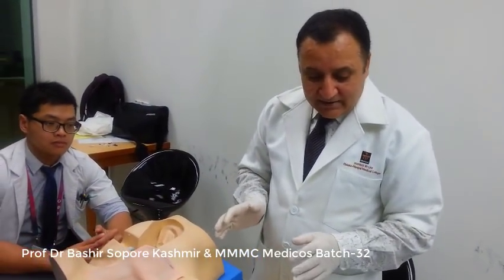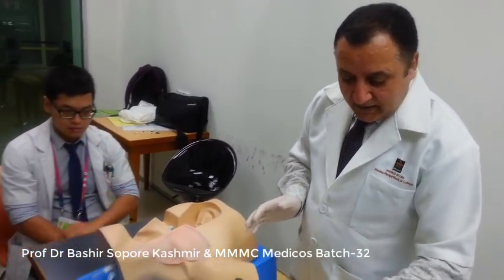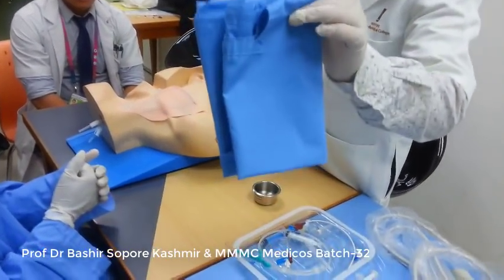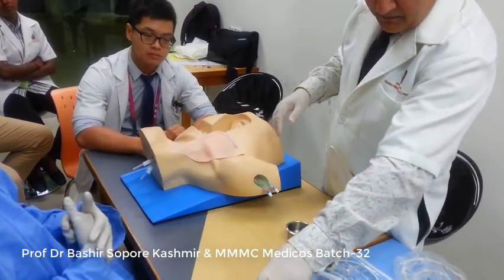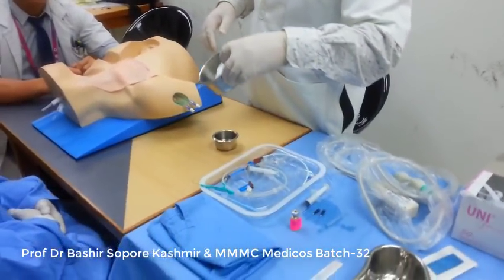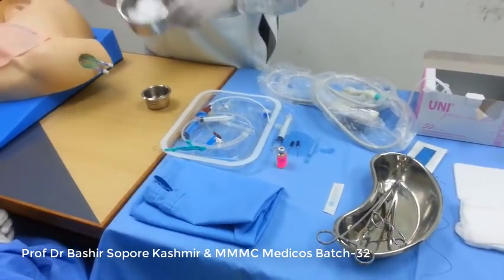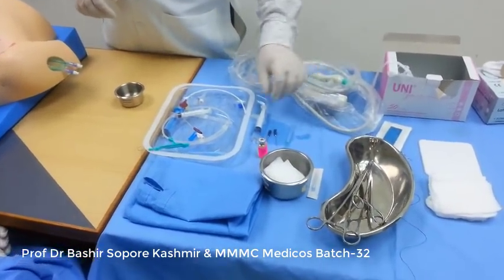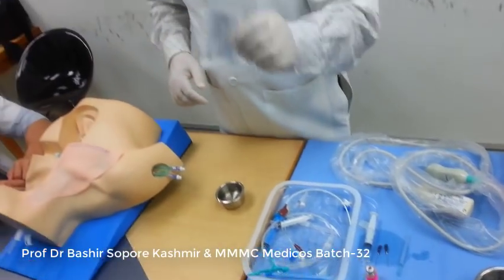Then we have other parts of the equipment. We have a draper here, by which we can drape the area. Then this is the gauze, and we can clean with the gauze, right? And then we have suturing material here. We have to anchor the catheter.